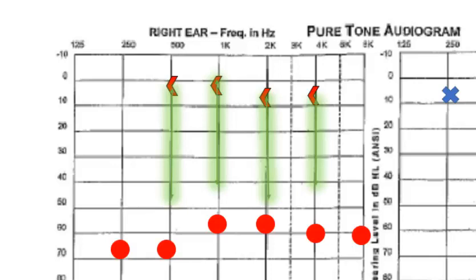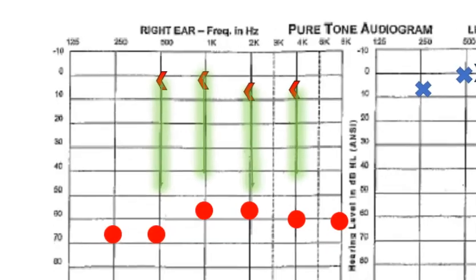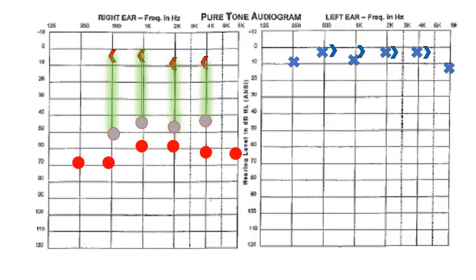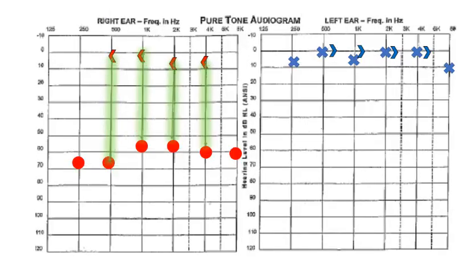If the true IA values in this situation were the actual min-IA ones, then the right ear air conduction signals would have entered the bone tissues of the head at these min-IA levels, and the subject would have been able to hear them there. Instead, the signals remained with the right ear at least up to the point of the unmasked air conduction responses. Let's look at 1000 Hz.